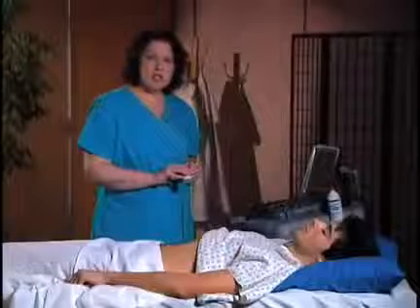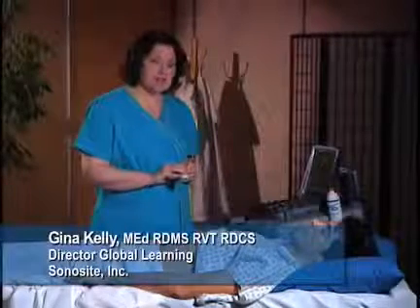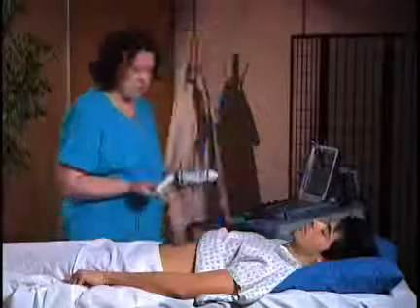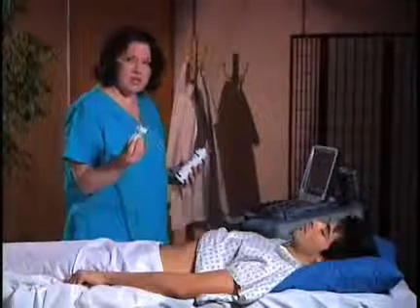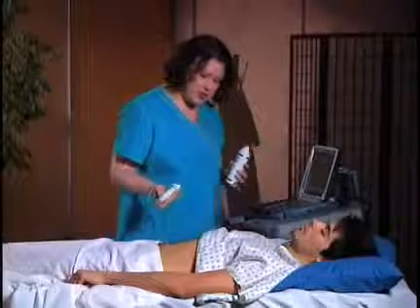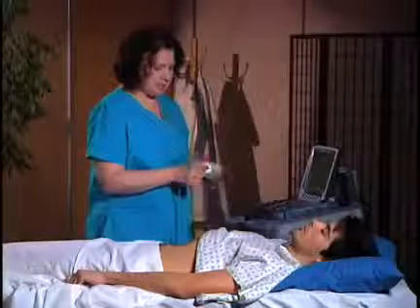Another examination you can do in the ED is the evaluation of kidney for nephrolithiasis. And this is a relatively easy examination to do. We're going to do, again, using the phased array transducer, your all-purpose ED transducer. And the first view that we're going to look at is a sagittal view of the kidney.